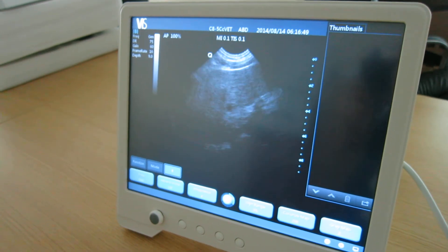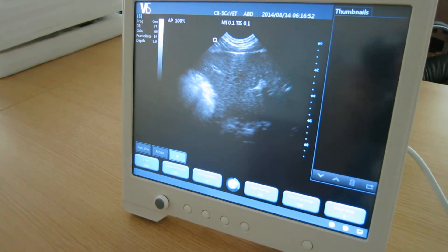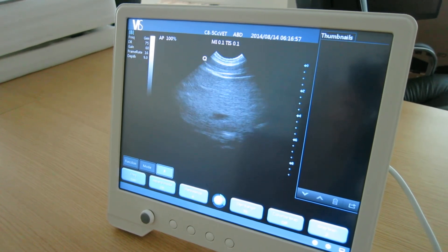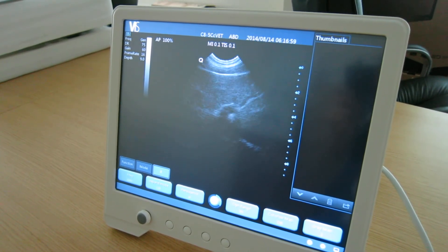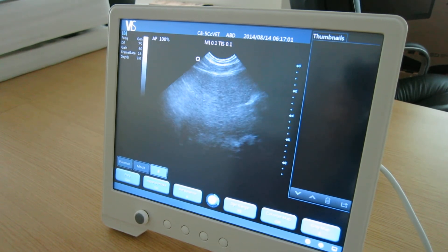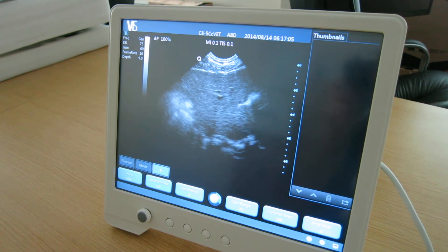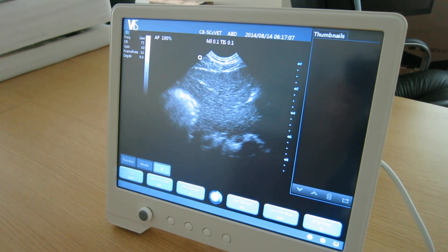Just scanning my liver — good image clarity, not grainy at all, good update speed from the probe when moving. Able to see everything required within the structure of the organ.